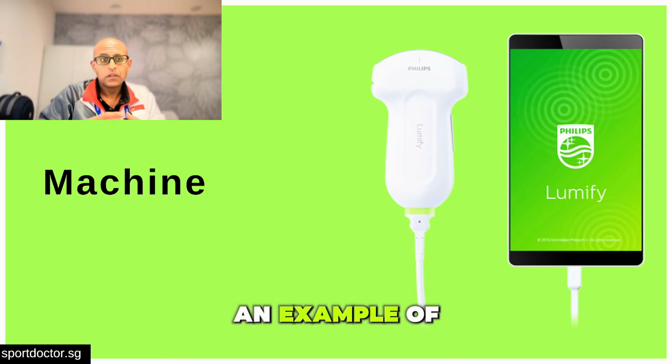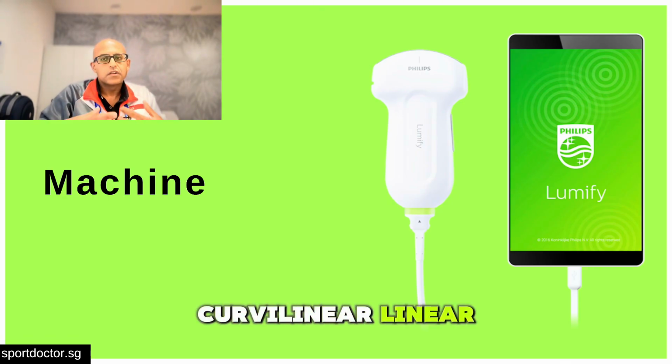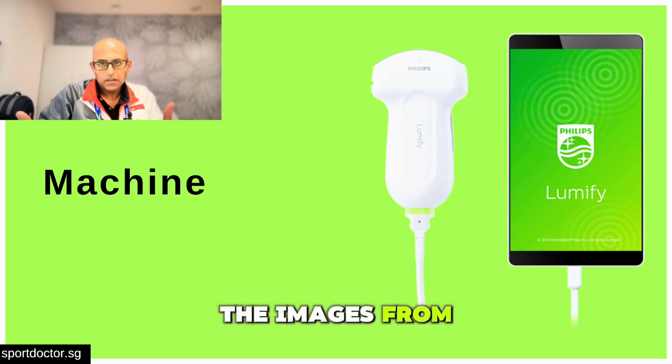And this is an example of a tablet. So we have the Philips Lumify, which has curvilinear and linear transducers, and you attach it to the tablet, and then you get the images from there.